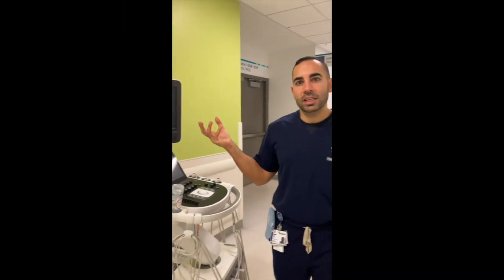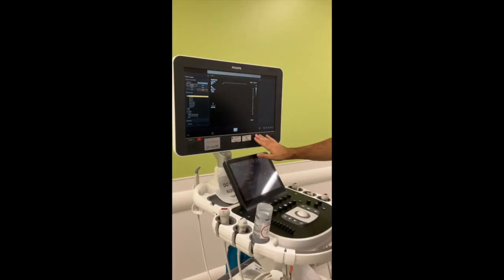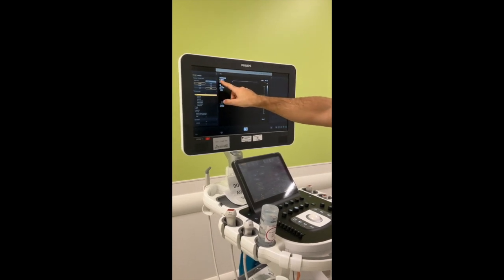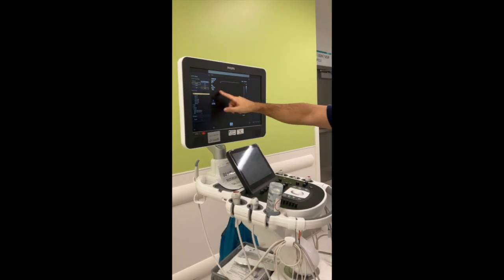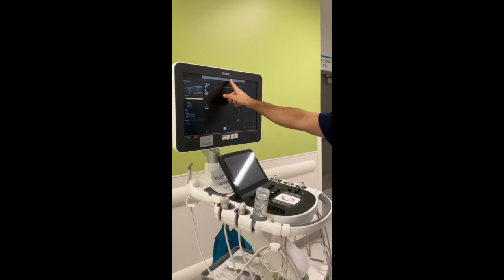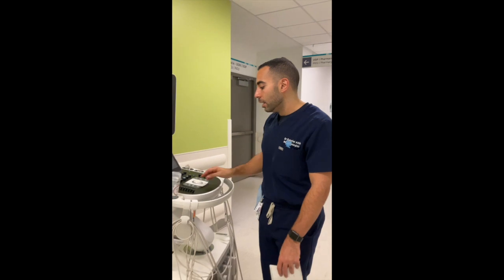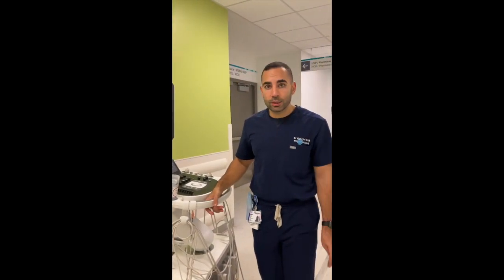On the actual acquisition of the images, it's very important to stay anonymous, which means that we will not see patient information on the actual image. Here you can see that the only thing we see is the date and time, and the probe which is the L15-7IO — the hockey stick probe — but we have no patient information. The first image will contain, typed with a label, the study ID of the research project.